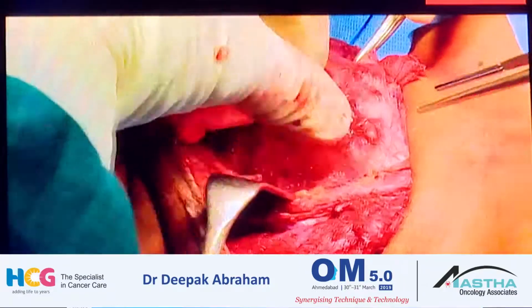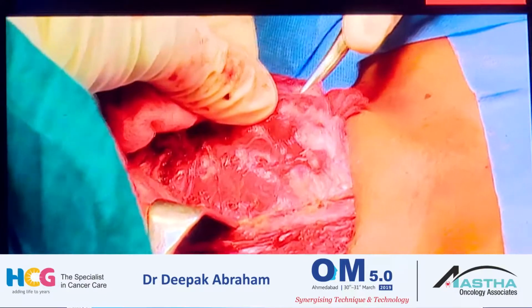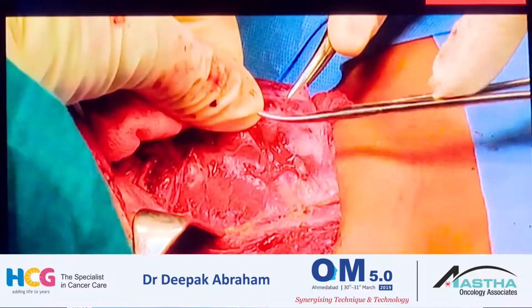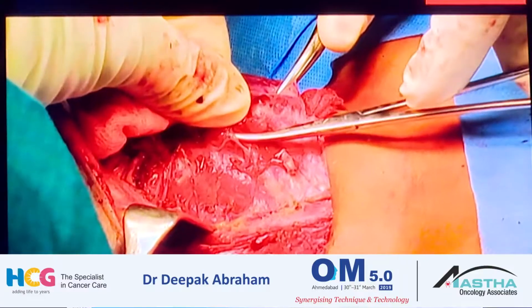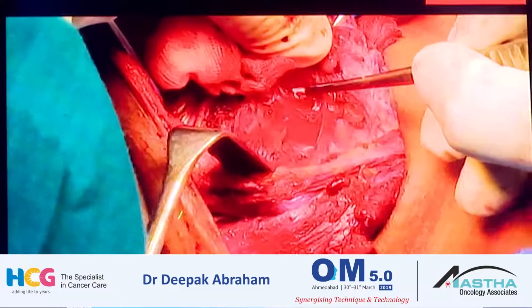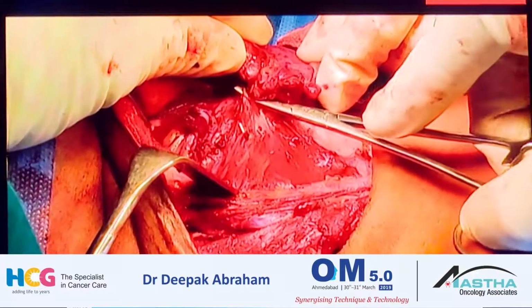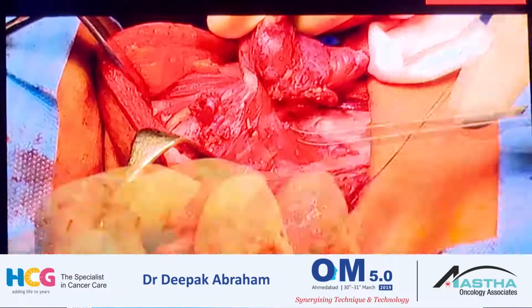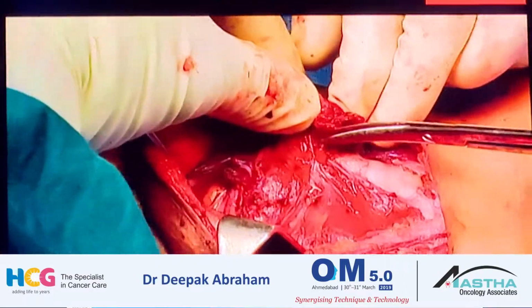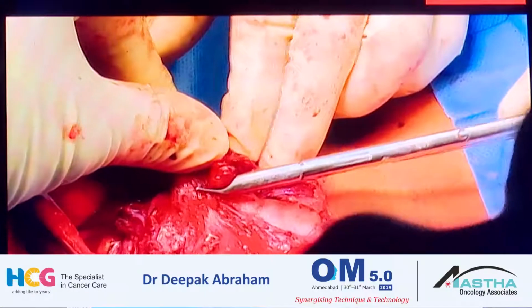And then that comes to the central neck, which is the part of the dissection, and that's the nerve being dropped down. So that enters into the central neck, and you can take off the last bit of the thyroid coming. I try not to be dogmatic about using vessel sealing devices, but when you're close to the nerve, use a tie, there's no problem in it.